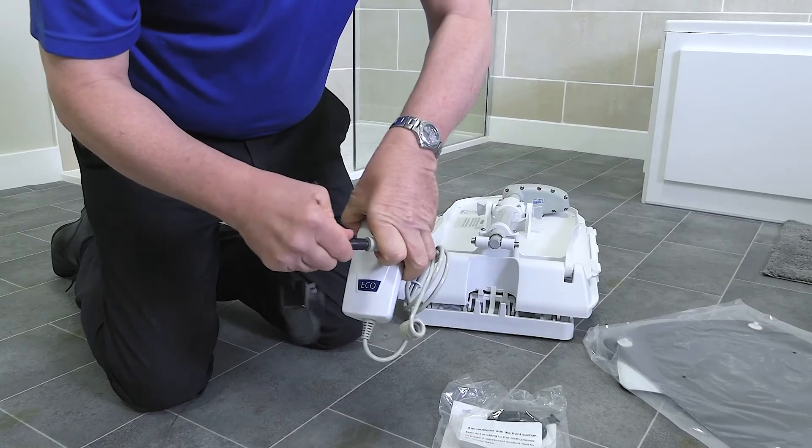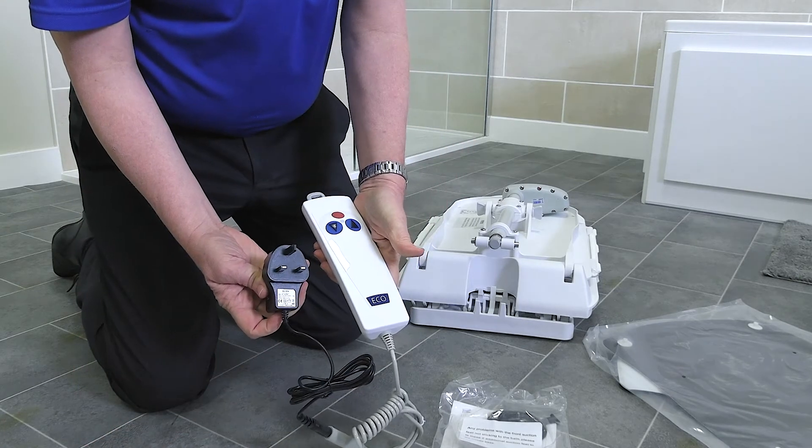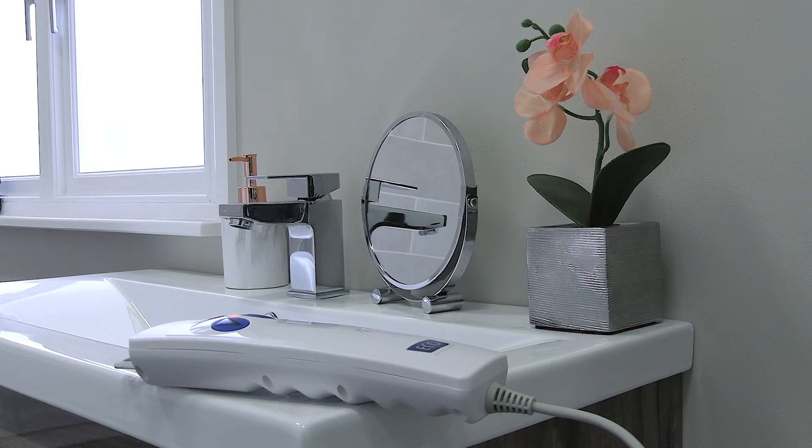Start by charging the Bath Lift Remote Control handset. We recommend charging the handset for at least one hour before first use.